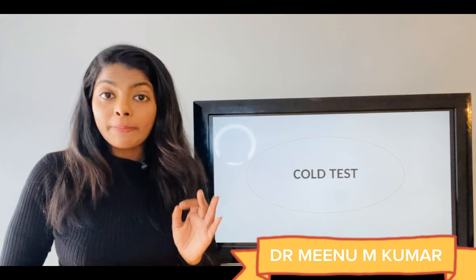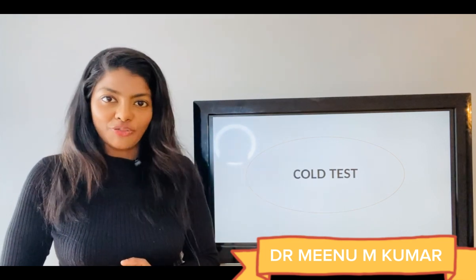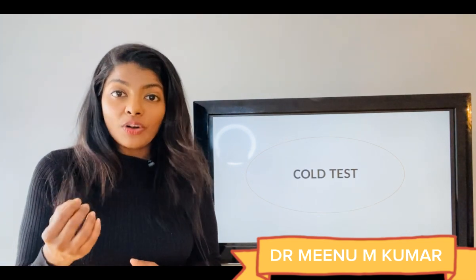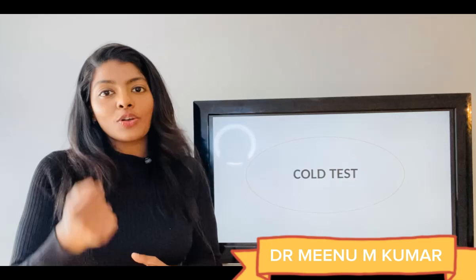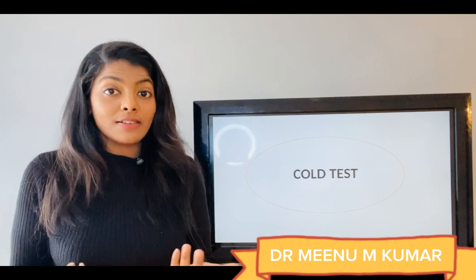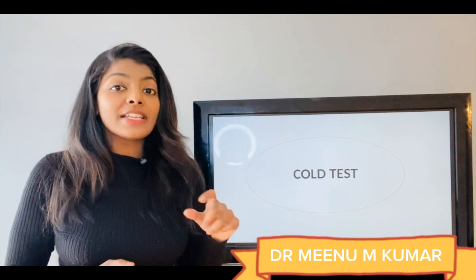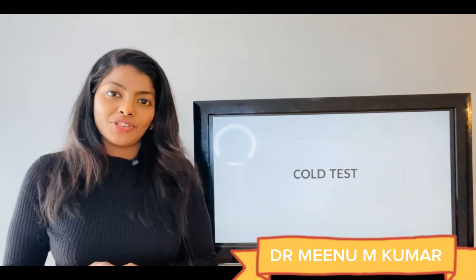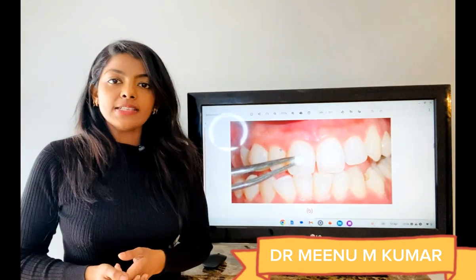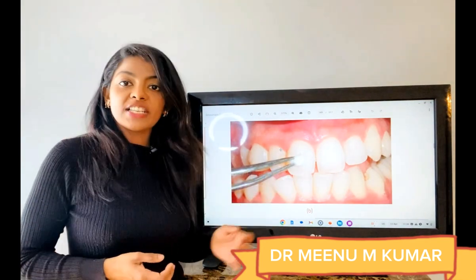For that, a cotton pellet is saturated with endo ice and then it is applied on the facial surface of the tooth. You can also perform the cold test by wrapping a sliver of ice in a gauze and placing it on the facial surface of the tooth. You can also make a pencil of ice by filling water in a discarded anesthetic capsule and freezing it in the refrigerator in upright position. So here is the image of how the cold test is performed using endo ice. For that, a cotton pellet is saturated with endo ice and applied on the facial surface of the tooth.